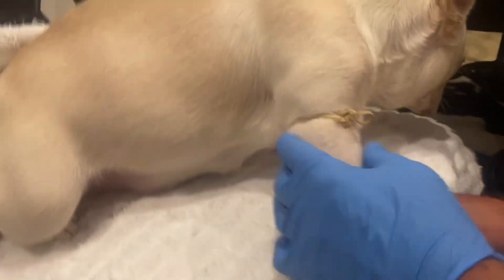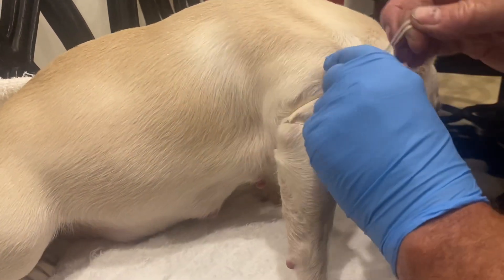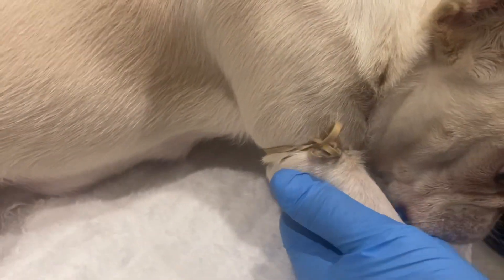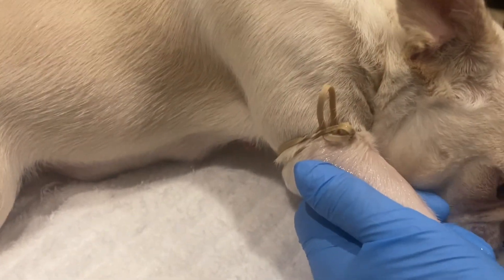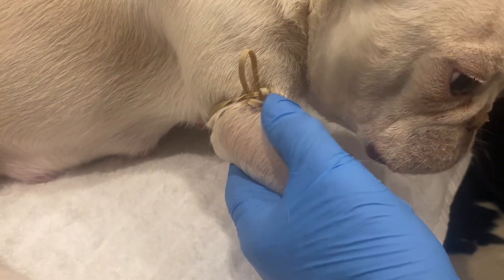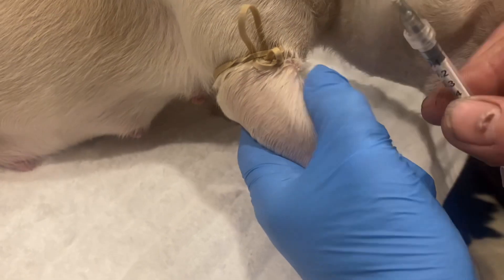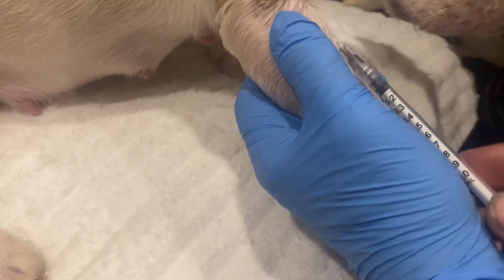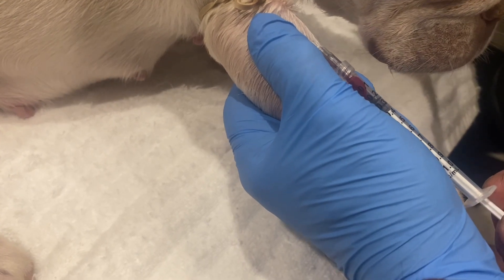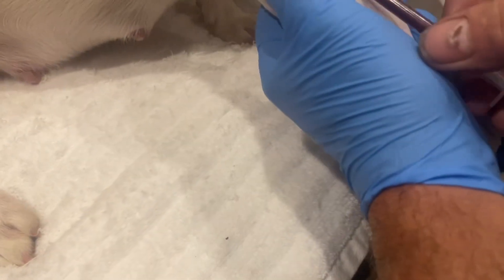We put the tourniquet right here. The reason I do it this way is it's so easy to remove — one-hand operation. Put it on, loop the knot through, and there we go. Then we wet down the area we're going to stick. It's easier if you shave this area first. Go in obliquely with the bevel up — it's easier with someone holding — and there we go. You need about half a CC.